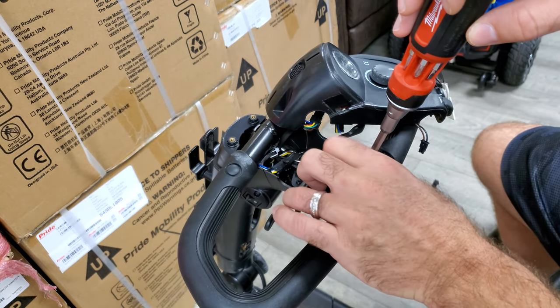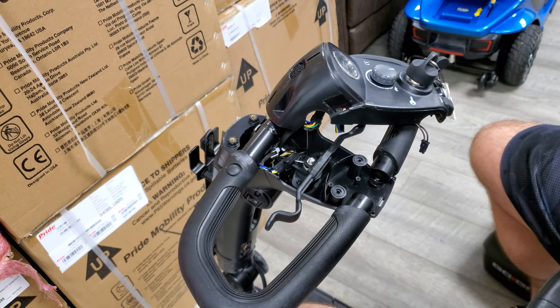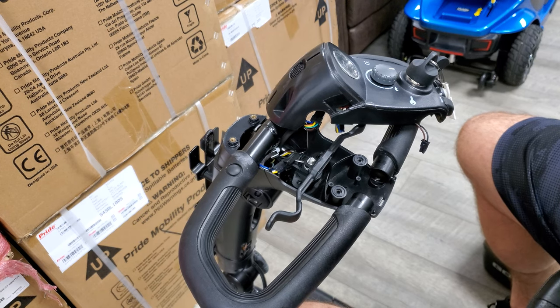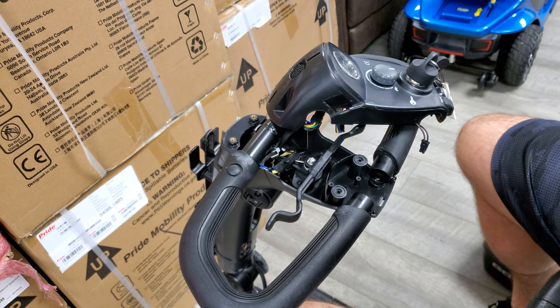This is the old buzzer — I want to get this out of the way and not get it confused. You can tell the difference though; this one has a little bit of debris on it.